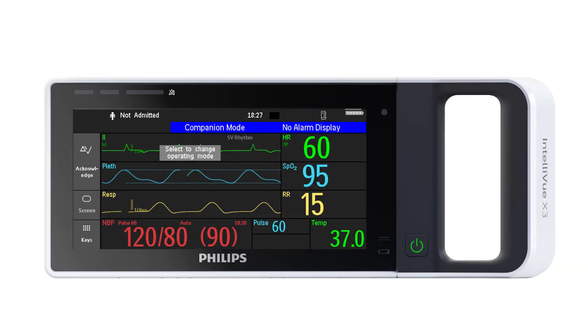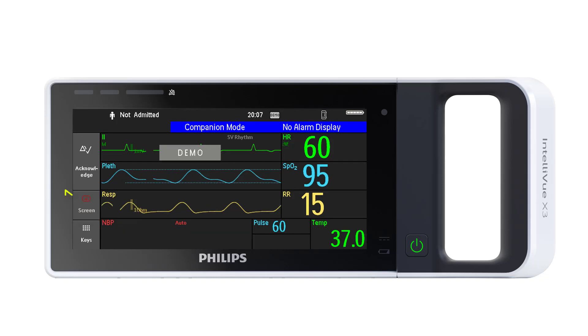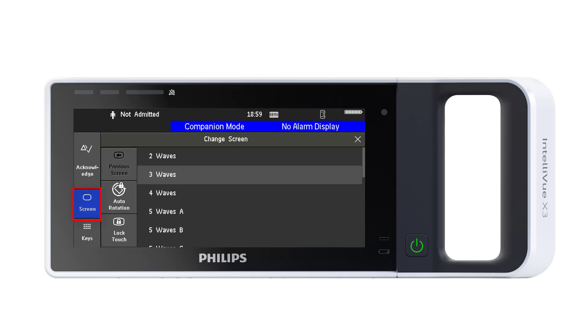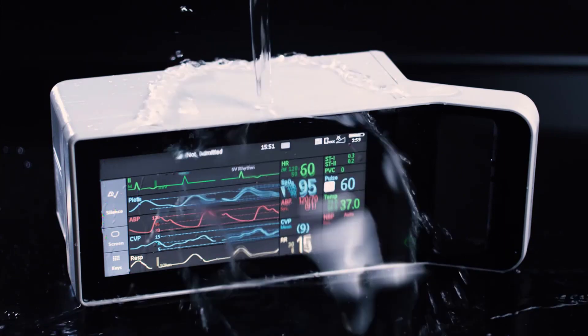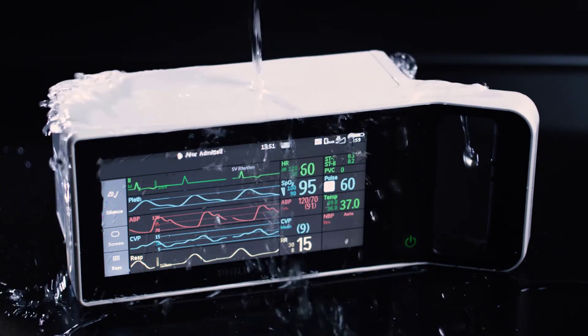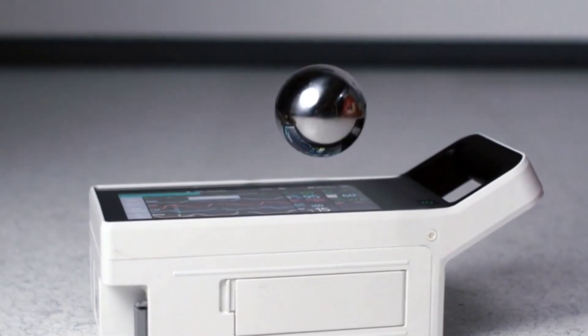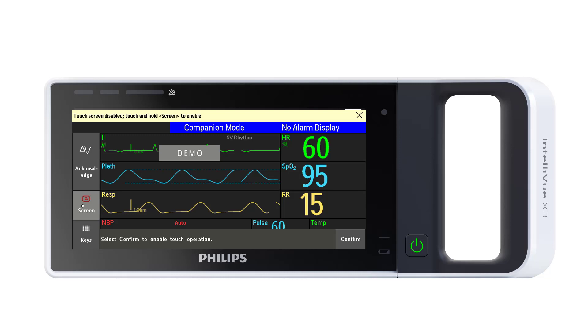A few words about the touch screen. You can lock the touch screen if you want to temporarily disable touch operation of the monitor. Touch and hold the screen key, and a padlock symbol appears on the key. To unlock, touch the key again, or select the screen key and then select the lock touch pop-up key. If the touch screen detects an operating problem — for example, fluid spilled on the screen or something unexpectedly contacting the screen — it will be automatically locked to prevent accidental operation.